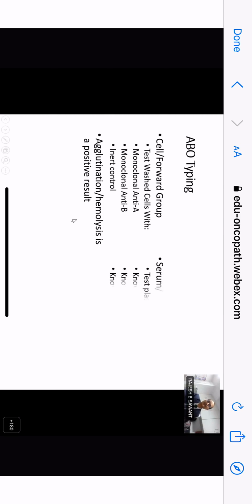Okay, coming to ABO typing. Again, very important here, because even today, surprisingly, we see many laboratories just performing the blood grouping with anti-A and anti-B antiserum, and the anti-D antiserum. So you get a forward ABO group and an Rh type. But it is very important to look at your serum group or your reverse group, where you test with known A1 cells, B cells, and O cells.